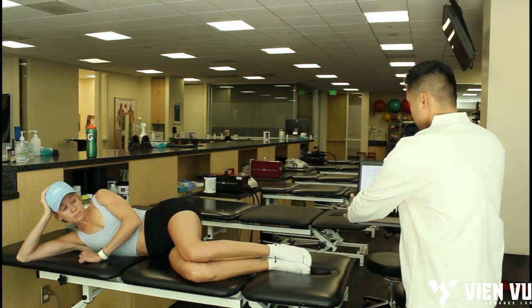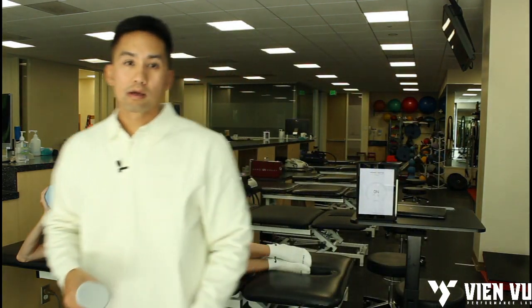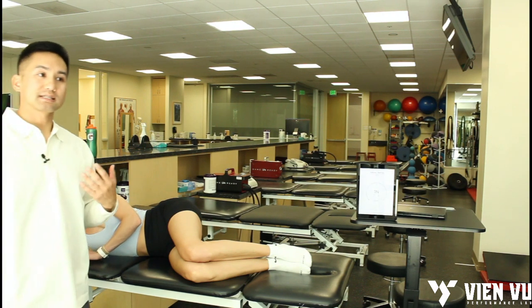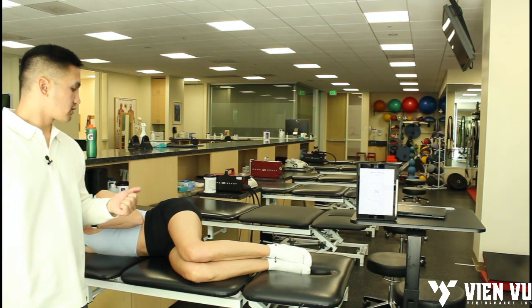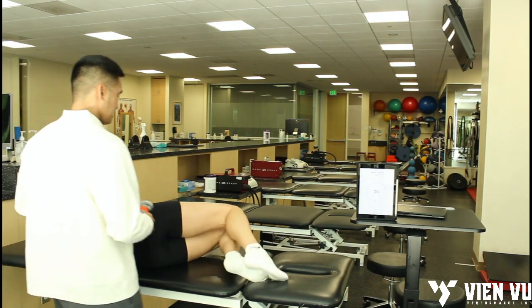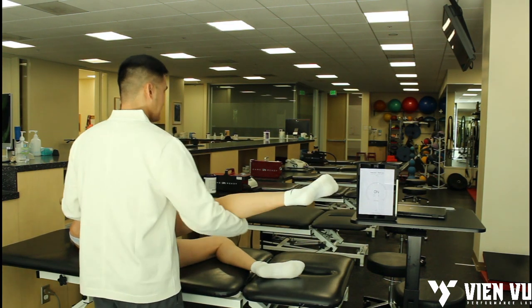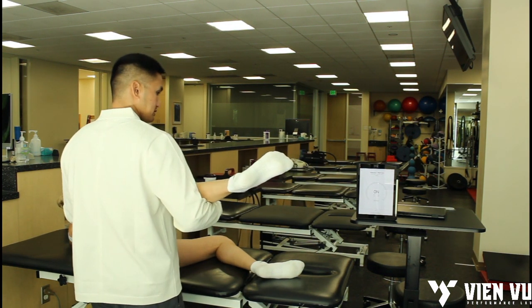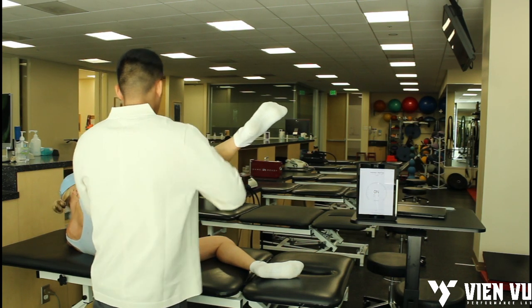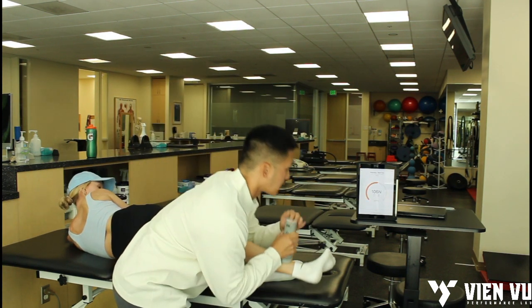I'll put this here so everyone can see what's going on — you can barely see it but you'll at least see the colors moving. The app wants me to test her right-sided abduction first. So Stacy, I'm going to have you turn that way. Your knee is going to be bent, this leg is going to be straight. Arms holding the table or not doesn't matter as long as it's consistent. Hold it up here, hold and try not to let me push — ready? And go. Push, push, push and rest.